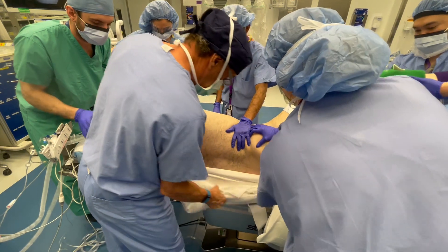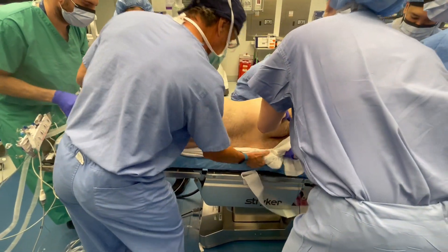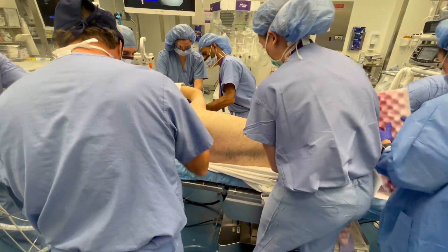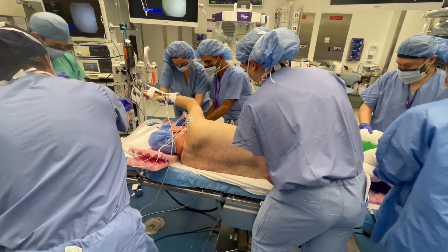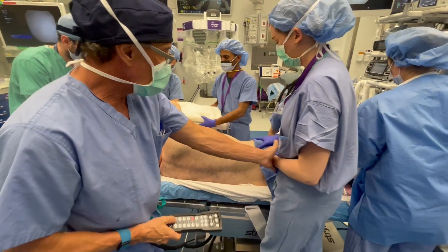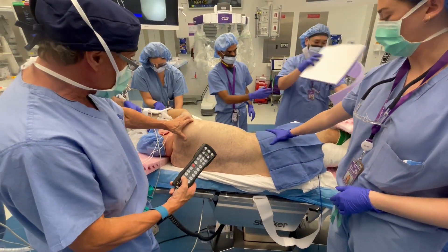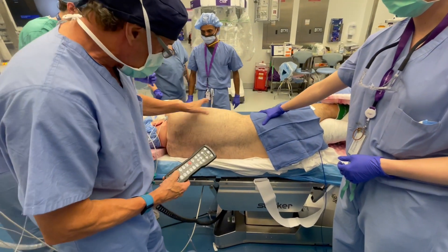This gets tucked here. Out of the way. Bed controls to the black box under the table to me, please. Alright, step over. Watch the controls if you have this bed. It's flexed down first, so the break is just about perfect.